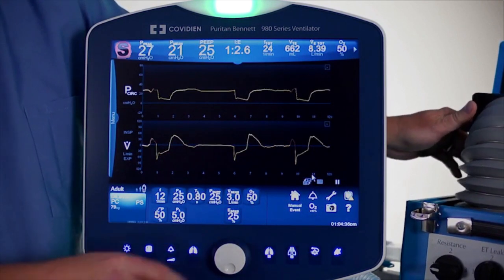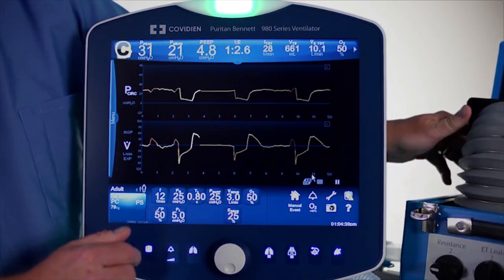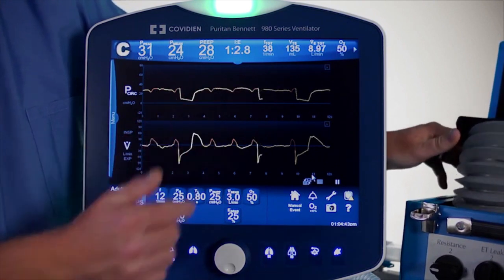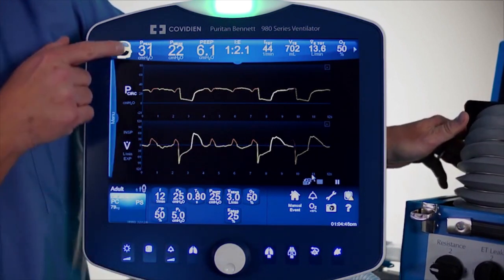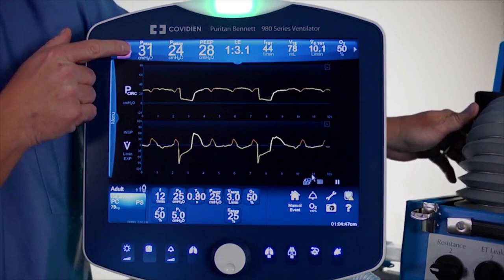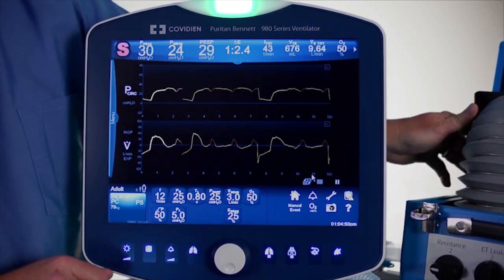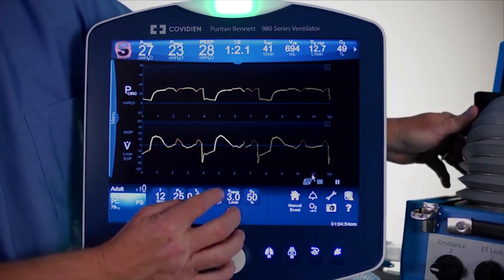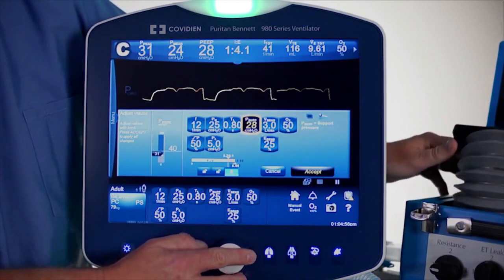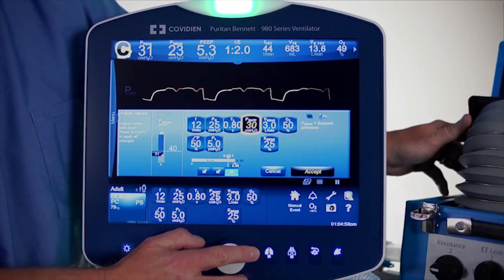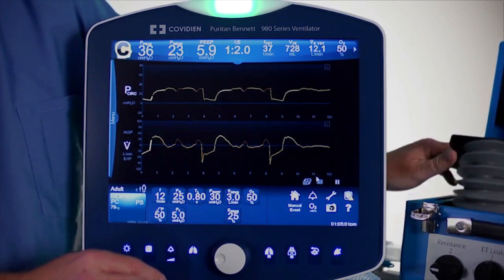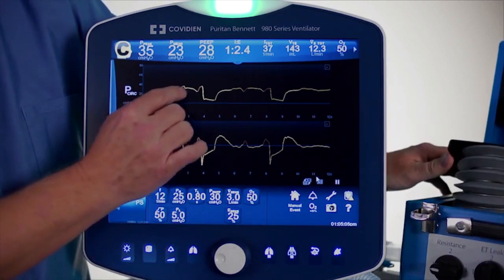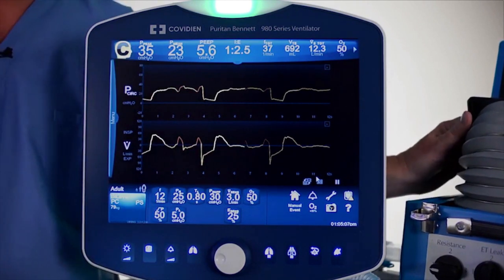Increasing pressure support up to 25 — now when the patient takes a spontaneous breath, they get a little pressure support at the top, and the peak pressure on spontaneous breaths goes up to 31. You can augment spontaneous breaths by increasing the pressure support, though you may have limits on the peak pressure for any given patient. Going up even higher, you can see those pressure support breaths being supported at a higher level.